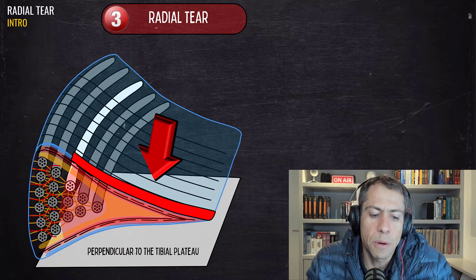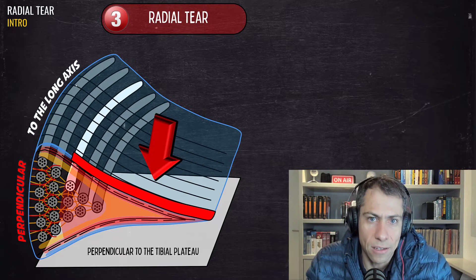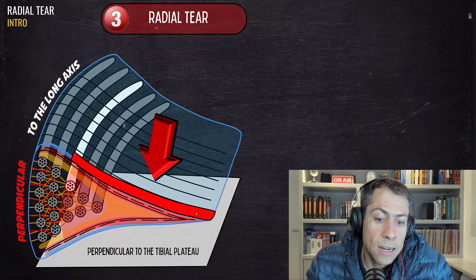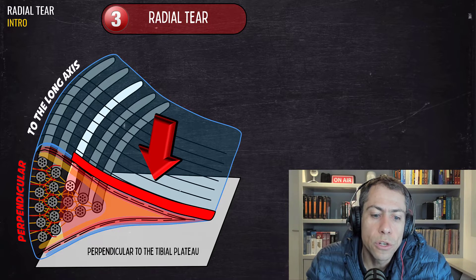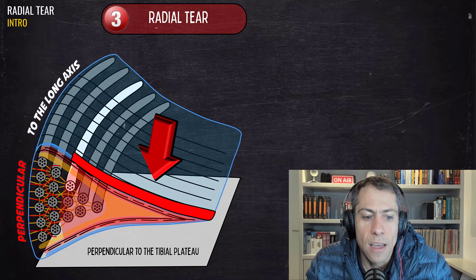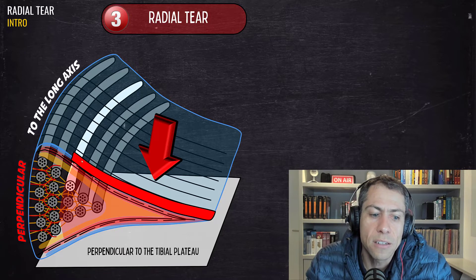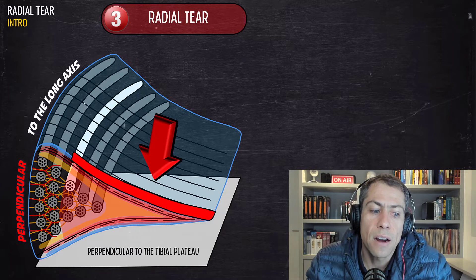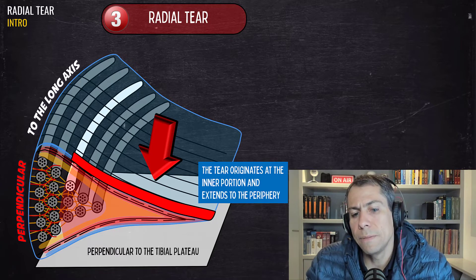The radial tear is perpendicular to the articular surface, perpendicular to the tibial plateau, and perpendicular to the meniscus long axis. The tear is a vertical tear, but it is parallel to the short axis of the meniscus — that's why it's called a radial tear. To differentiate: radial tears are parallel to the short axis, while longitudinal tears are parallel to the long axis of the meniscus.